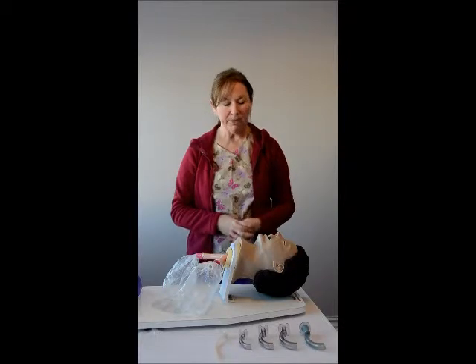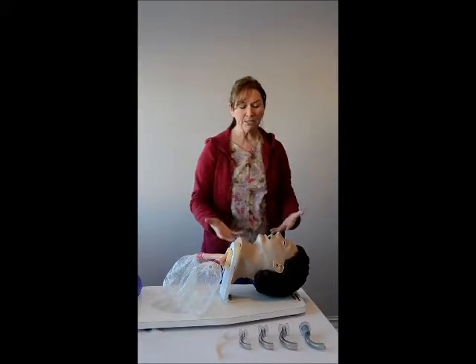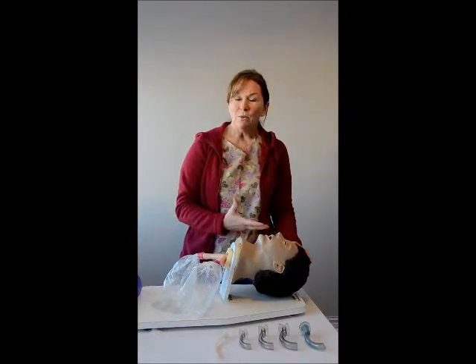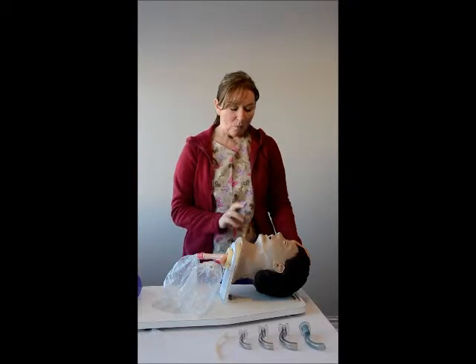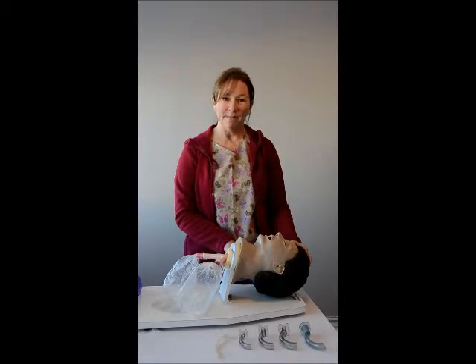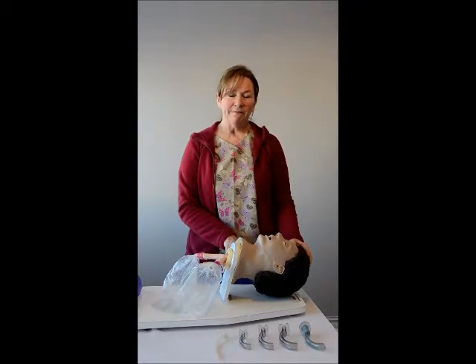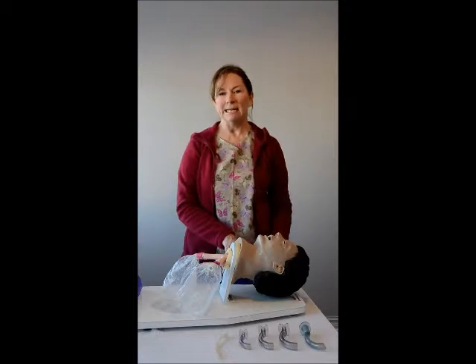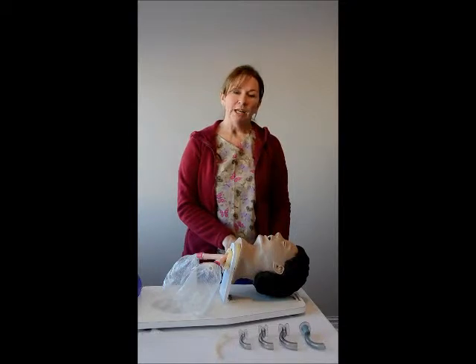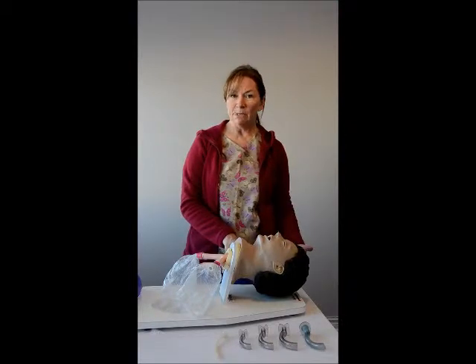Now we're going to look at a brief scenario with a patient presenting in respiratory arrest. I've come to this patient. First, I've established that they are unresponsive and not breathing, or there is an absence of normal breathing. While doing a pulse check, I've already called for help and activated the emergency medical response. I will take 10 seconds, no more, to do a pulse check. If I do not feel a pulse, I will immediately initiate compressions. In this case I do feel a pulse, so I know they have a viable heart rate at this moment.